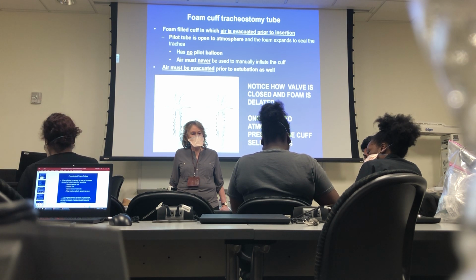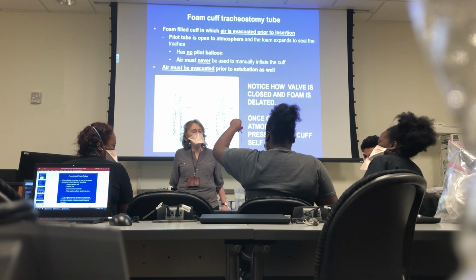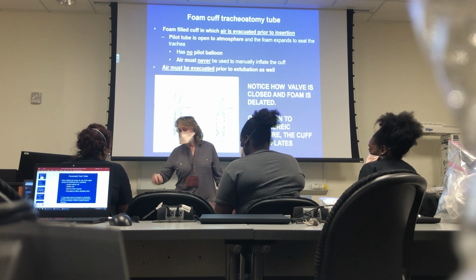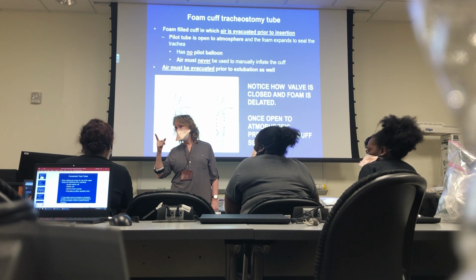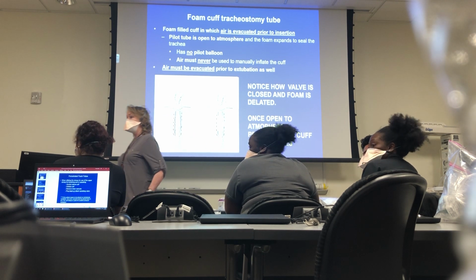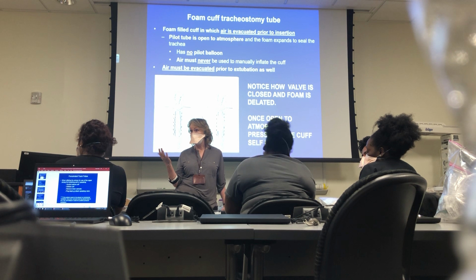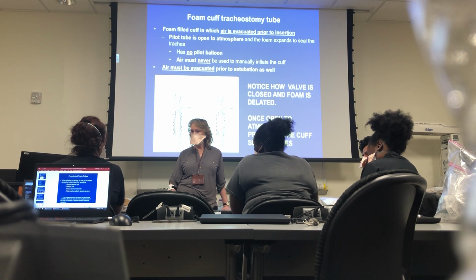Okay. Did you get it all out, or do you still have more in there? There's a little more in there, but now when you let it open, it'll inflate. Got it? So a lot of air fit. I'll tell you what, those ET tubes, did you see how much air can fit in those cuffs? You could put 40 cc's in those, but that's not how much you need to seal a trachea. It's usually about 10, and then you have to check the pressure. Okay? Make sense?